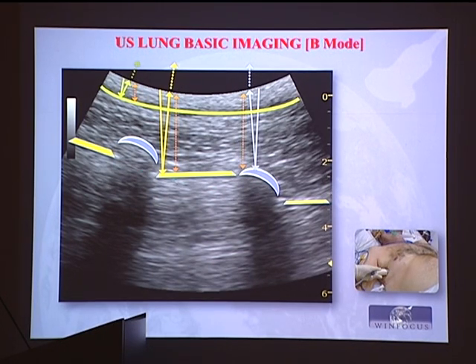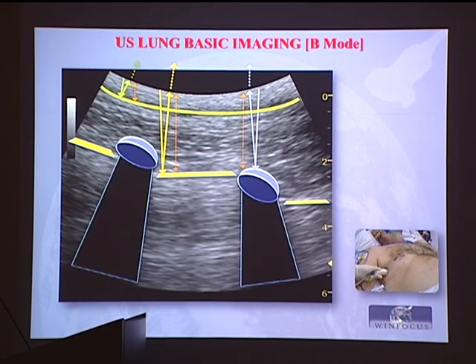So what you see here is the pleural line, sonographic interpretation or description. Meaning what? These 3 anatomical structures. Okay? What's happening in this image? Beyond the costal profile that is hyperechoic, there are hypoechoic, dark areas, acoustic shadows, representing what? Nothing. They are artifacts because the energy is absorbed by the bone, calcified bone.